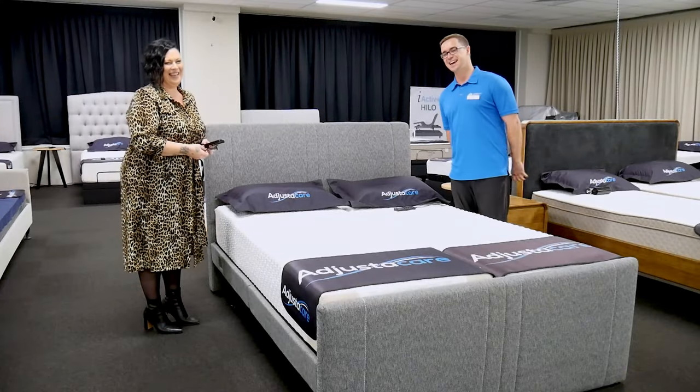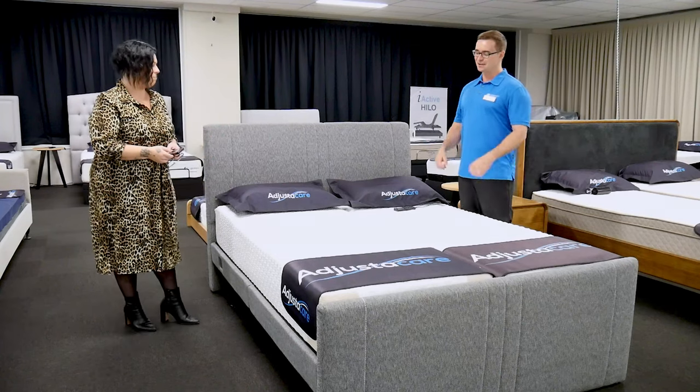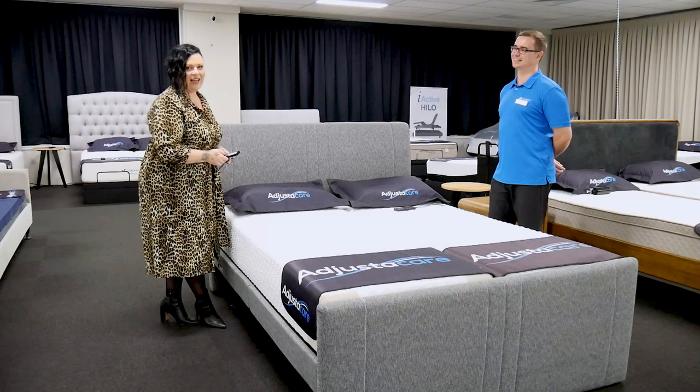We're at Adjusted Care today with Trish, looking at a range of beds. What have we got here today? We have got our Avanti Easy Flex.